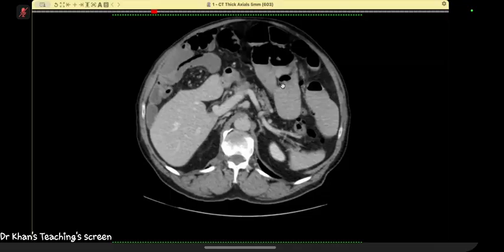The surgeon asks you, should we go for a laparotomy? There is no cause to undergo laparotomy in this case because it is a benign finding and it can cause pneumoperitoneum in patients. Okay, thank you.